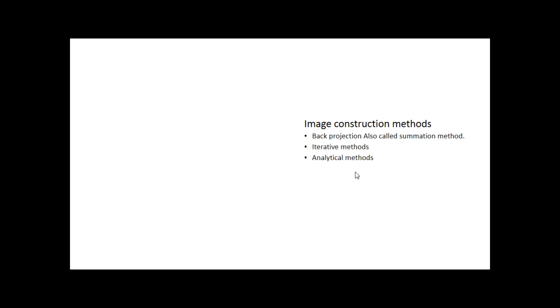I was advised not to go through it, but I love the principle. So I'll just go through a basic one of image construction, CT image construction. The oldest one is the back projection method, the first method that was advised. And I'll just explain it very quickly.